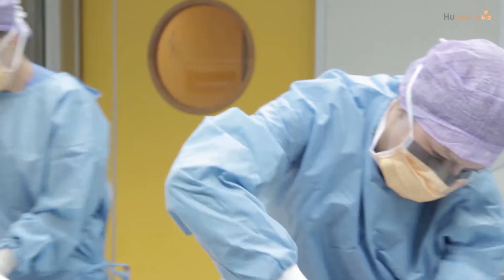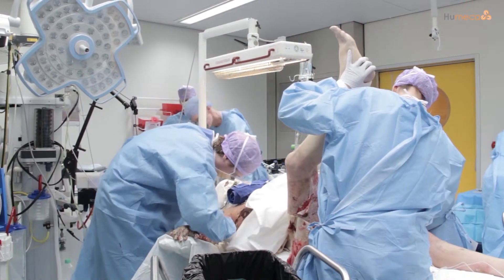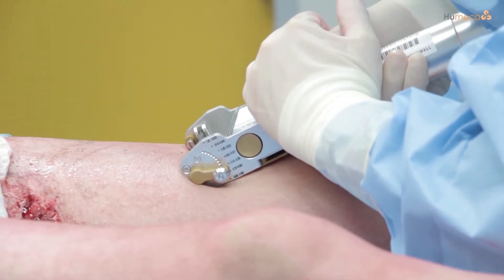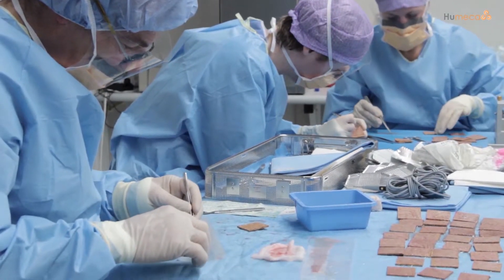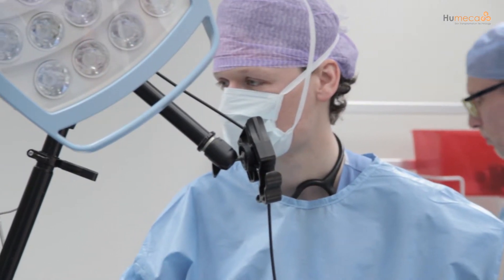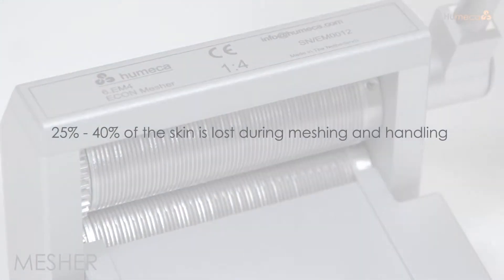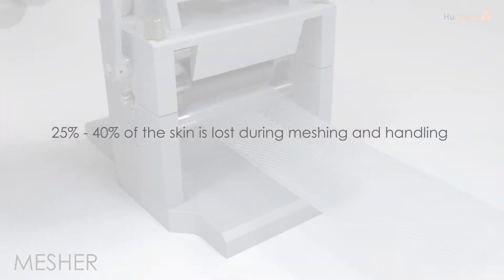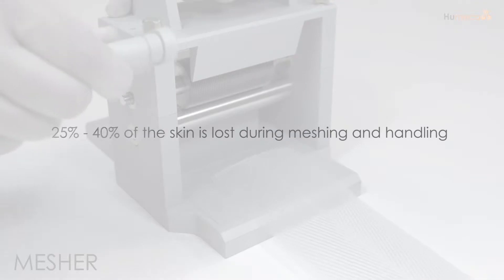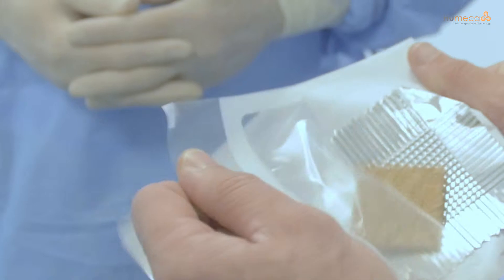All burn surgeons worldwide face the same problems in treating severe burn wounds, such as limited donor sites and difficulty in handling widely meshed skin grafts, especially when expansion ratios of 1 to 3 and higher are required. The expansion ratios of these mesh grafts are not as realistic because 25% to 40% is lost during meshing and handling. We are proud to be the exclusive supplier of the modified MEEK technique, the solution to all of these problems.